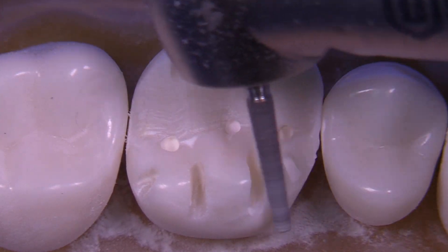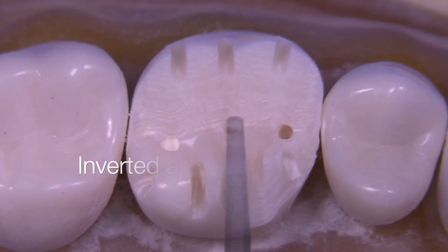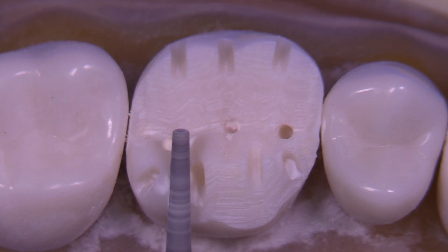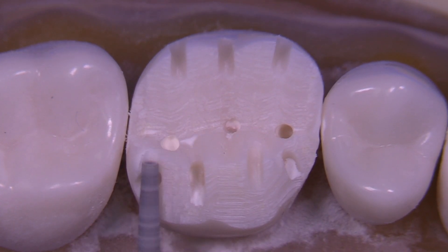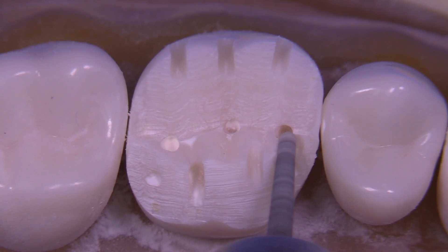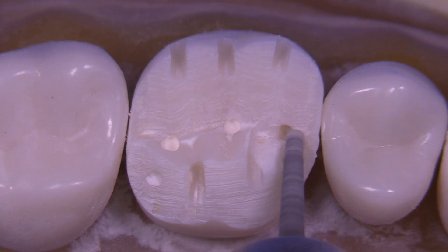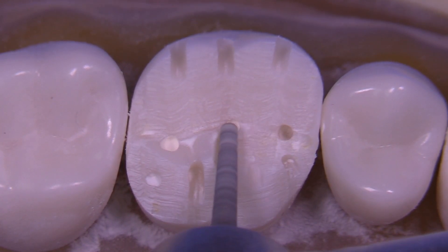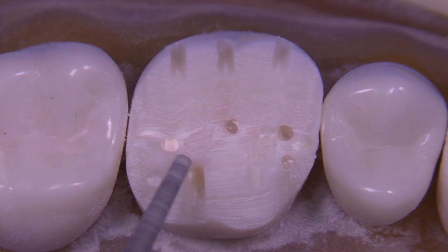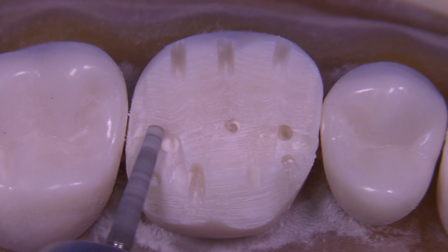Now we're utilizing exactly the same inclination we just used for the c-plane — we're going to use that again for the a-plane. You can turn the bur upside down if you need to; if the head of the handpiece is hitting the c-plane while you're performing the a-plane, you can turn the bur upside down. Here we're using the bur to create the b-plane, the middle plane, just working across it, understanding that those depth cuts are going to be a constant reminder of where we want to end up.